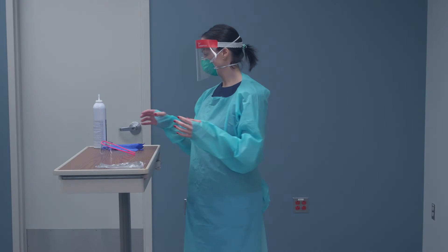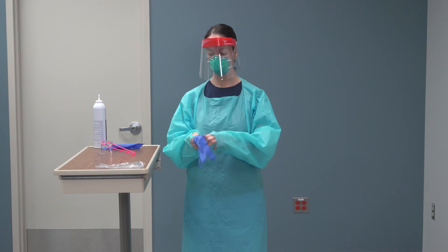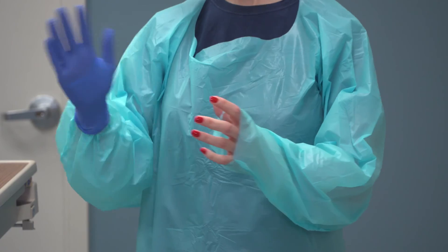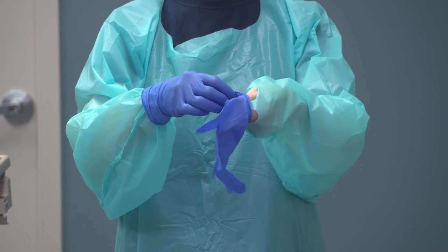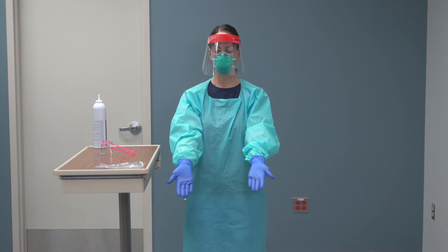Apply gloves, ensuring the sleeve of blue isolation gown is tucked into gloves and the skin of your wrists are not exposed. You are now ready for entry into the room.